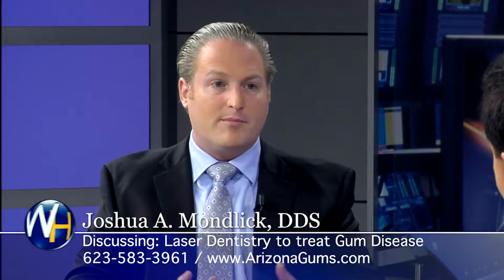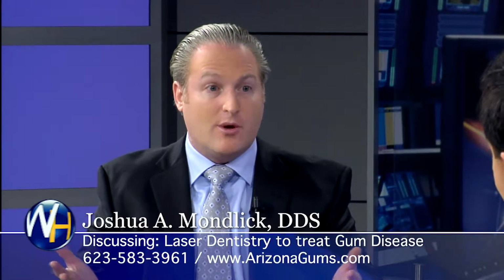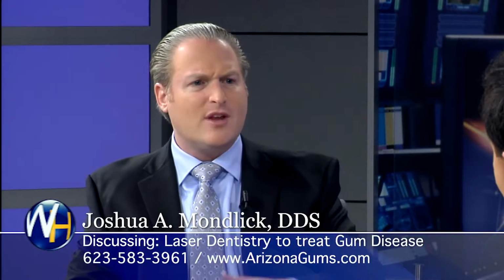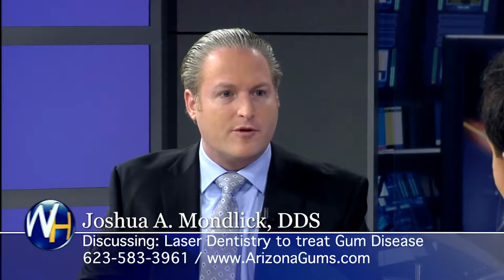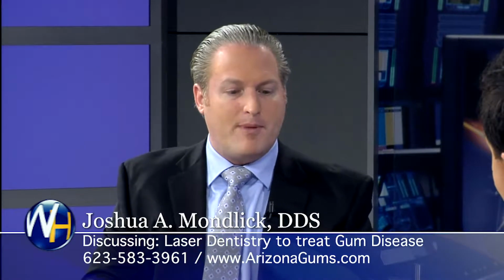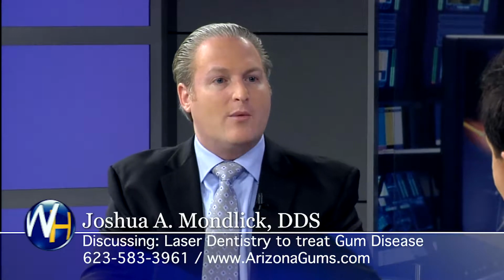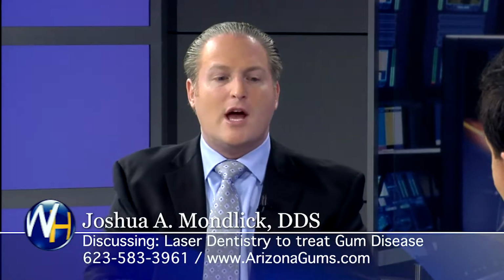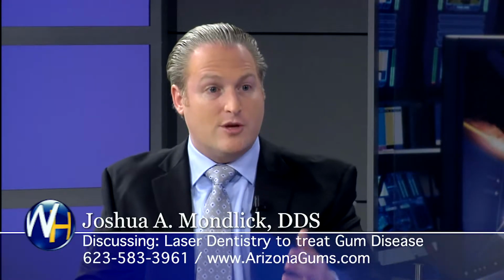And the thing with it is that after these patients leave, they have a lot of soreness. It's uncomfortable because we've actually reflected and pulled back their gum tissue, so that takes time to heal. The healing takes longer, and it's a little bit more uncomfortable for patients. We can medicate for it, but I want to move the conversation and say that there's another way that we can do it, and it's a lot easier for patients, particularly in the way that they heal after the procedure. So that's with using the laser.